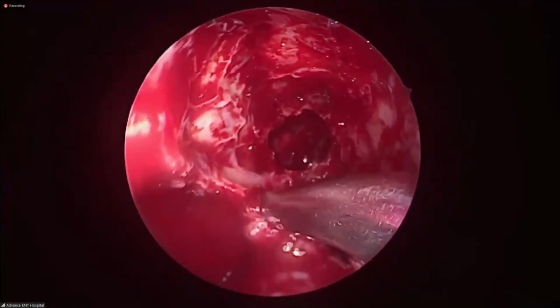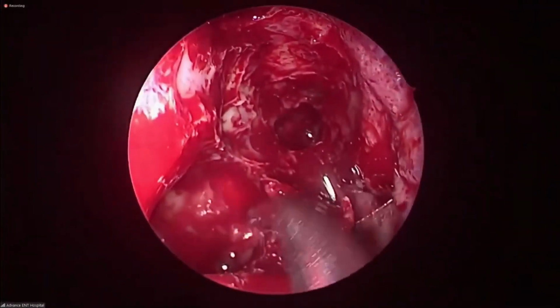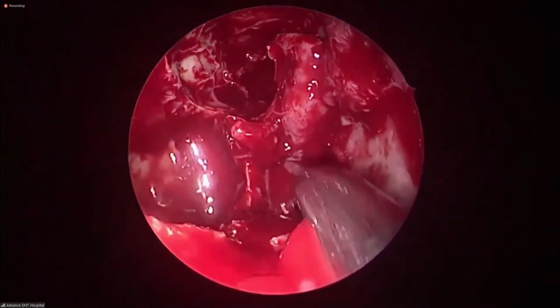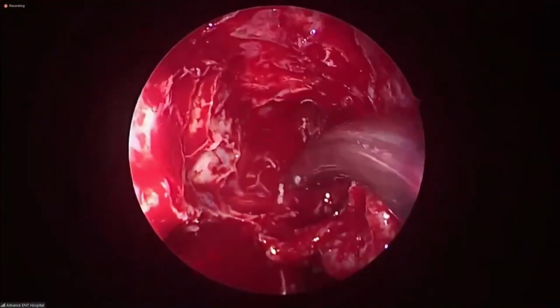Is that the part of uncinate, sir, that is left? Pardon? Is that the part of uncinate that is left? This here? No, sir, not uncinate. It's part of the posterior end of the middle turbinate, which I have not cut yet. Okay, sir.